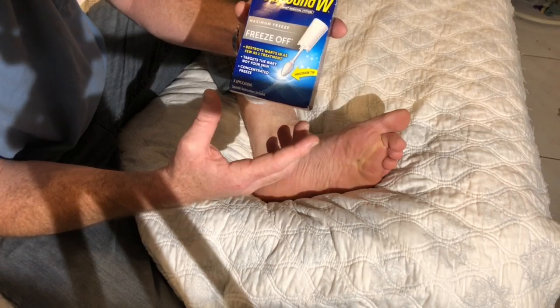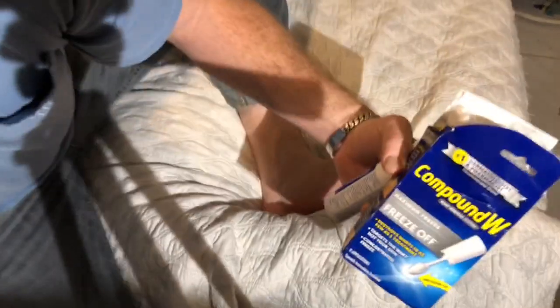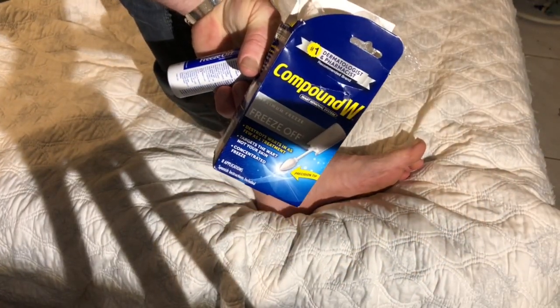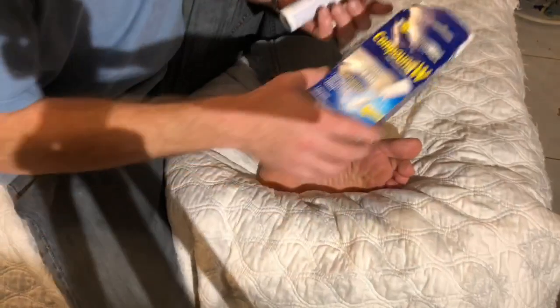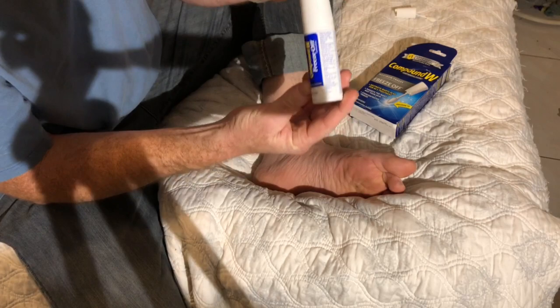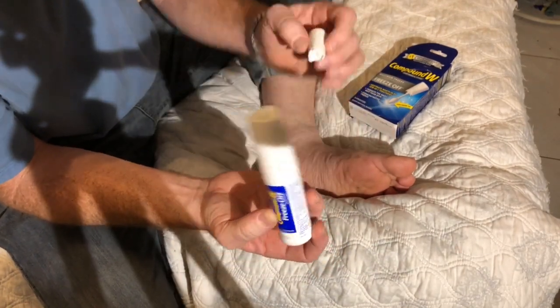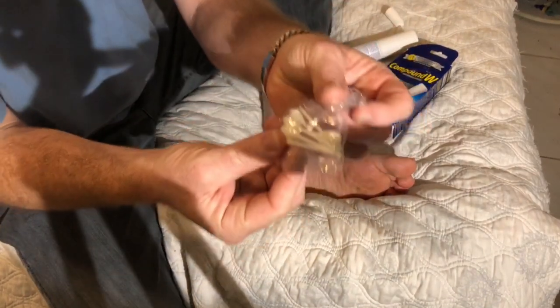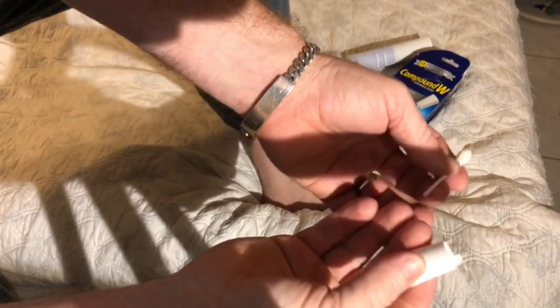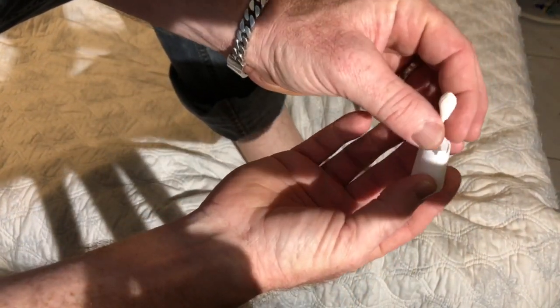I want to show you how to remove a wart with a Compound W wart removal system — the Freeze Off. Let's get started. Basically there is this right here, and there are these things right here.